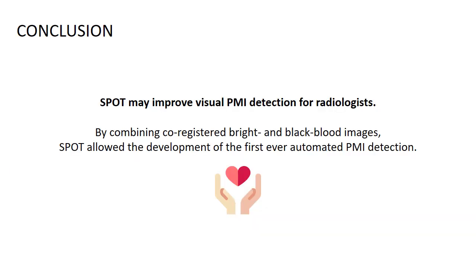So to conclude, SPOT may improve visual PMI detection for radiologists. And co-registered bright and black blood images facilitated the development of an automated PMI detection that leads to a better decision for the patient and for the risk stratification.